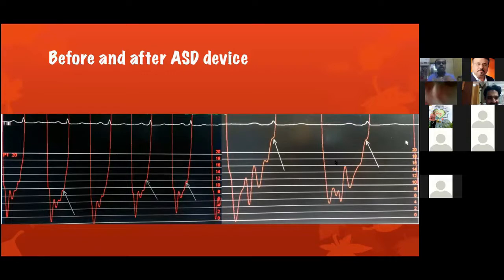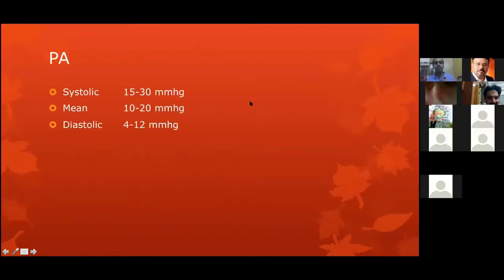So the pathology will reflect fortunately in an ASD onto the LA and onto the RA very easily, and so always you will be able to identify a restrictive LV physiology right at the beginning of the Cath when you assess the RA pressure.